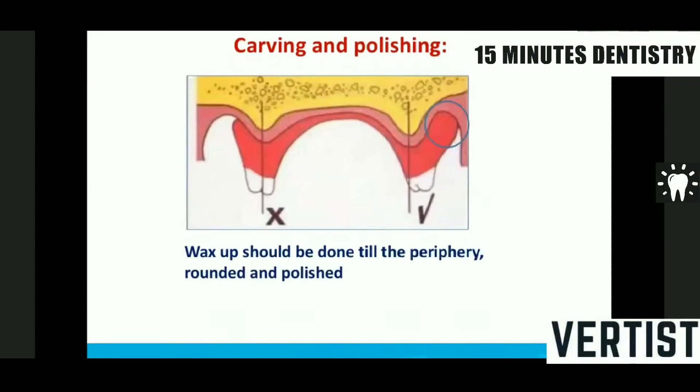Let us see carving and polishing. Many times what we have seen is that you do good teeth arrangement, but when carving and polishing, the relations you have established go for a toss because you soften the wax so much that the position of the tooth changes.